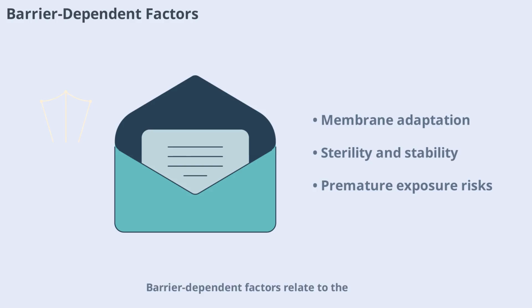Barrier-dependent factors relate to the membrane itself and its handling. Inadequate adaptation to the root, non-sterile technique, instability of the barrier, premature exposure to the oral environment, and early loss of the membrane can all compromise regeneration. Proper membrane selection and meticulous surgical technique are vital for success.